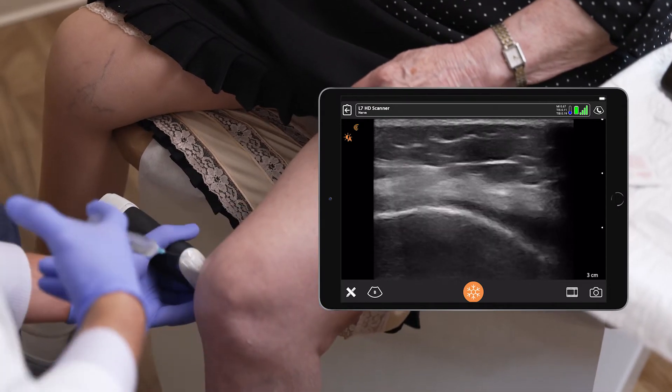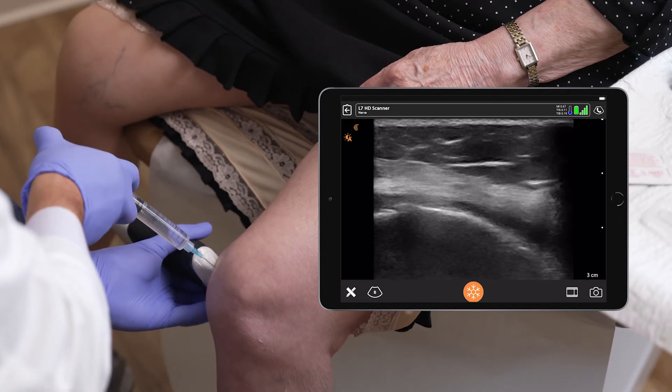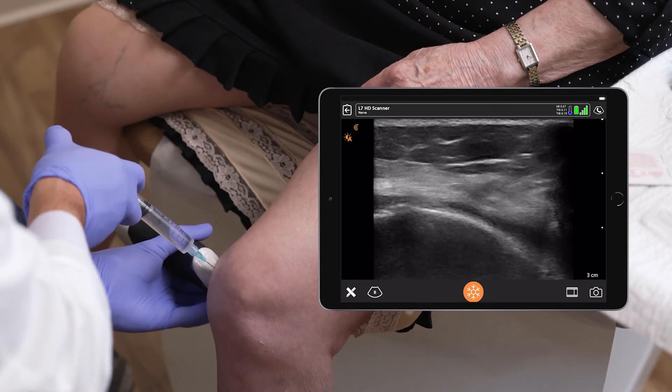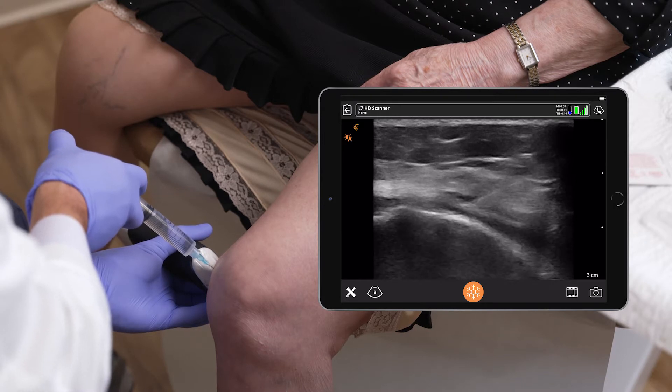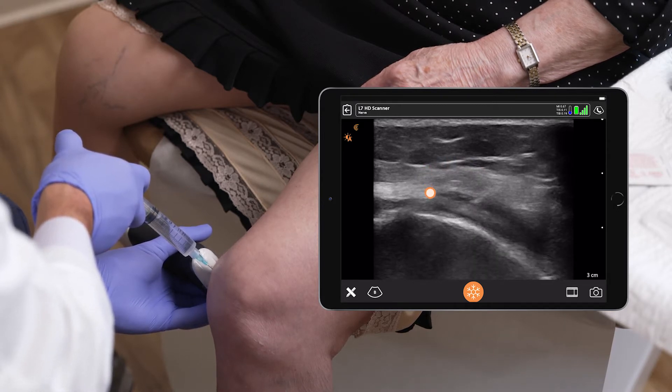A little pinch. Passing one to two mLs around the genicular nerve with bupivacaine quarter percent.